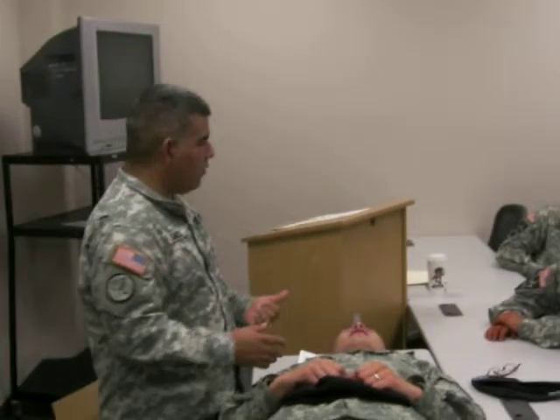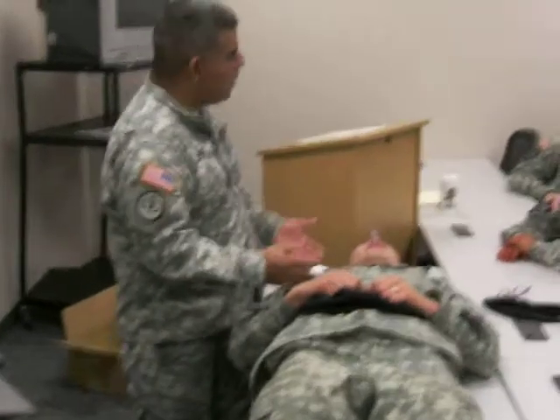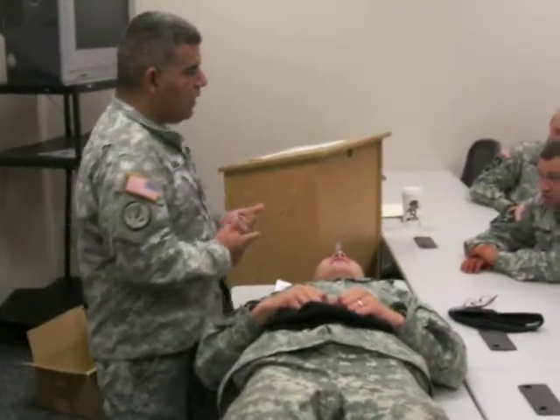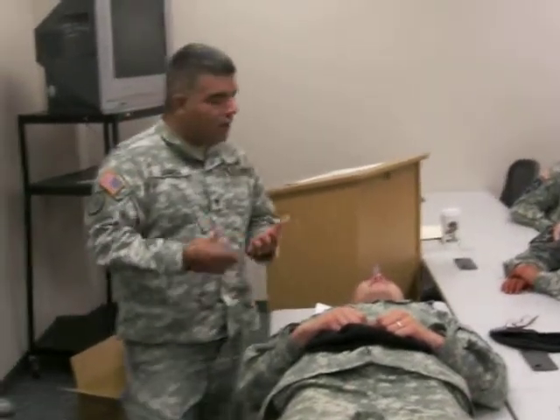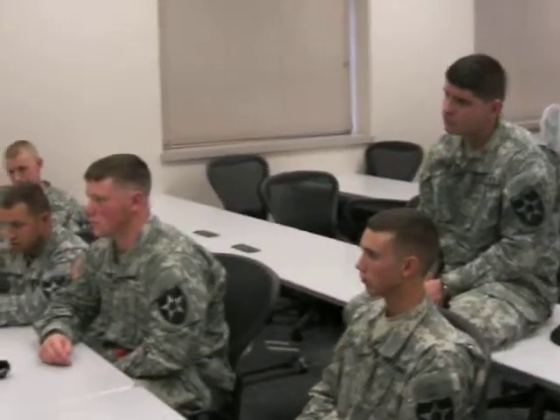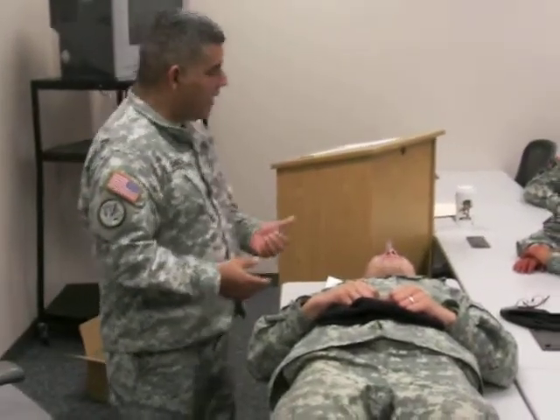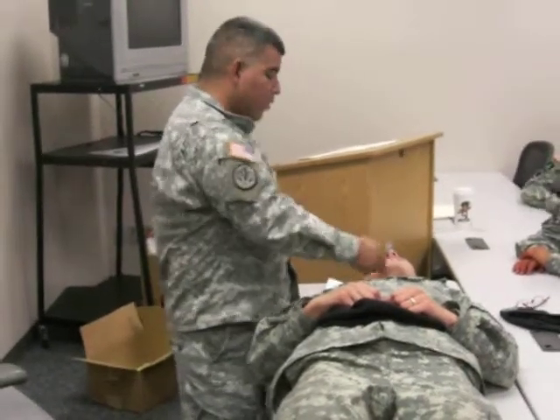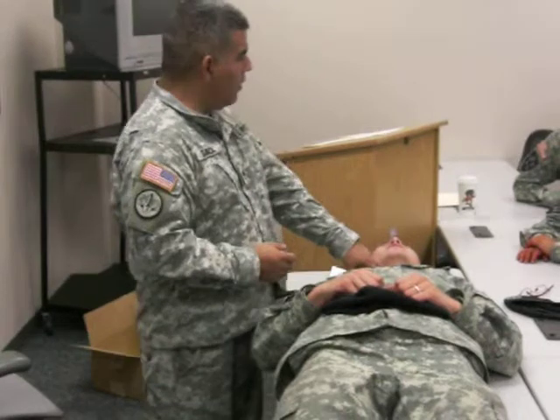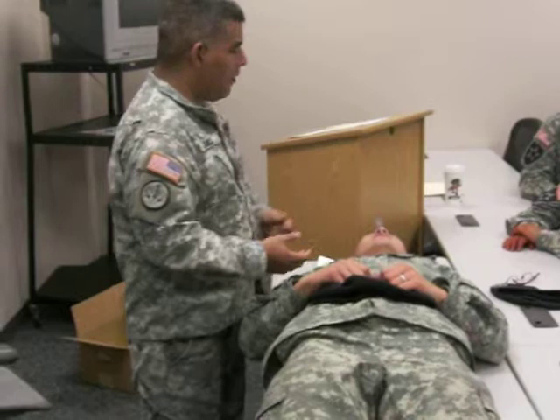Okay, does anybody have any questions over anything we've discussed today? Actually, take that back. What we discussed today is the need for an airway and the interventions we can use. We talked about some indications and some contraindications of why we would put the NPA in, and it kind of helps that we have a live casualty to do this on. Additionally, we have other means of opening the airway and some more advanced airway management. If he was really compromised, we can actually cut his throat open a little and put a tube inside his throat to give him an advanced airway. And that's a little bit higher up.